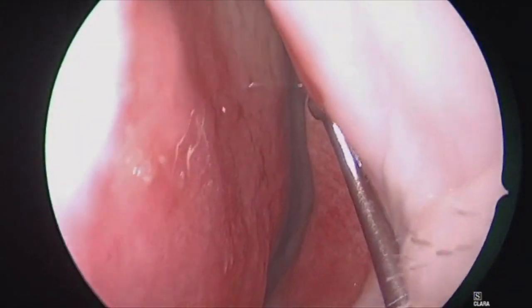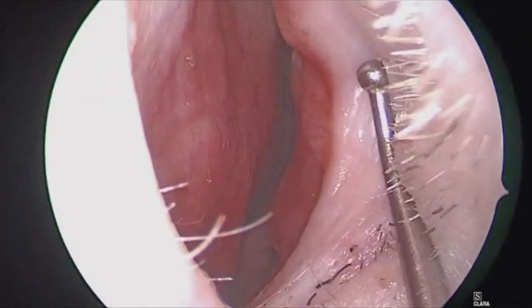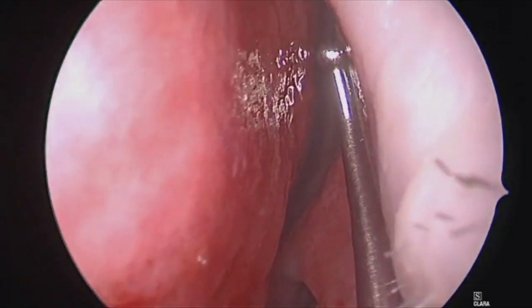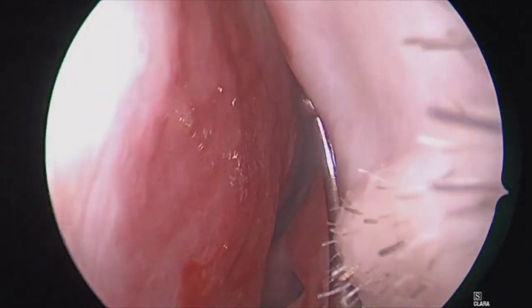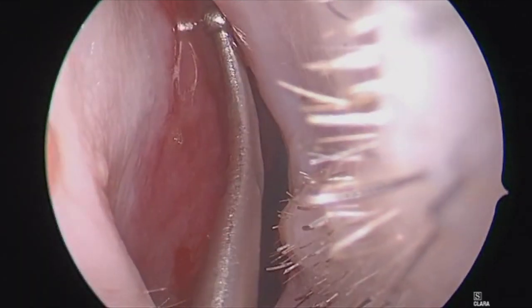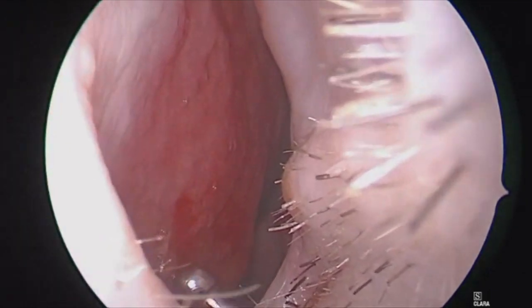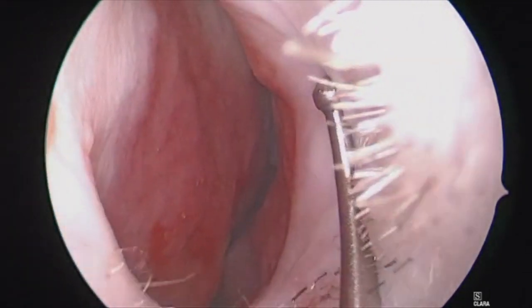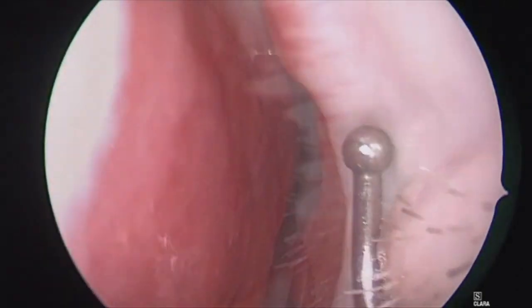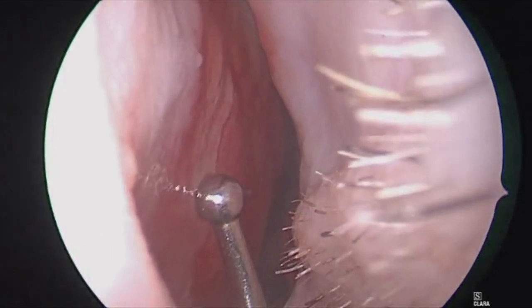The next step is planning where your initial mucosal incision will take place. Ideally, this will take place anterior to where the deviation starts. Here I'm pointing out multiple places where you could consider making it, but we'll make it in a more anterior fashion. It should be pointed out that your cartilaginous incision does not have to exactly be where your mucosal incision is — you can stagger these to a certain extent and make your cartilaginous incision somewhat posterior to your mucosal incision.